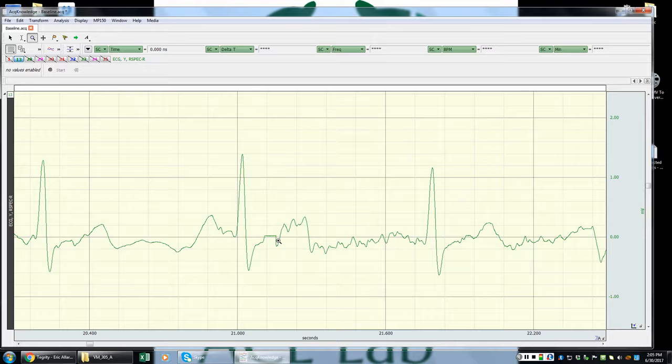Well, that's not going to be a problem because typically we don't care about that portion of the wave when we're doing our RSA analyses. We only care about these R peaks right here. Okay, so this little drop off in signal isn't going to be a problem unless this drop off extended all the way through to where we would expect this peak to be, and then this peak is no longer present. Okay, in those instances we would have to do some extrapolation.